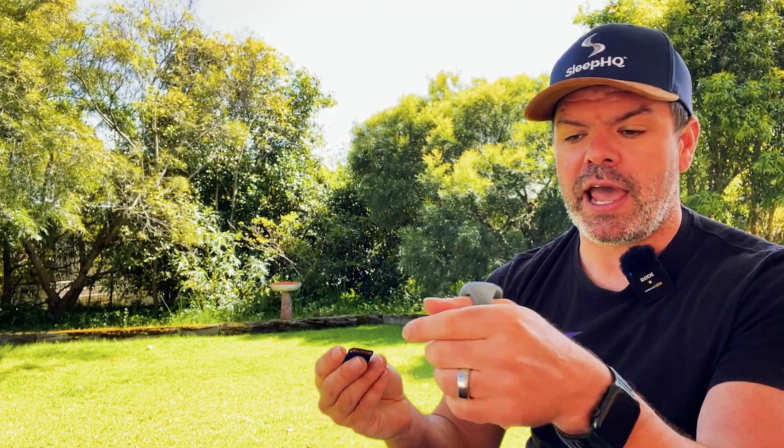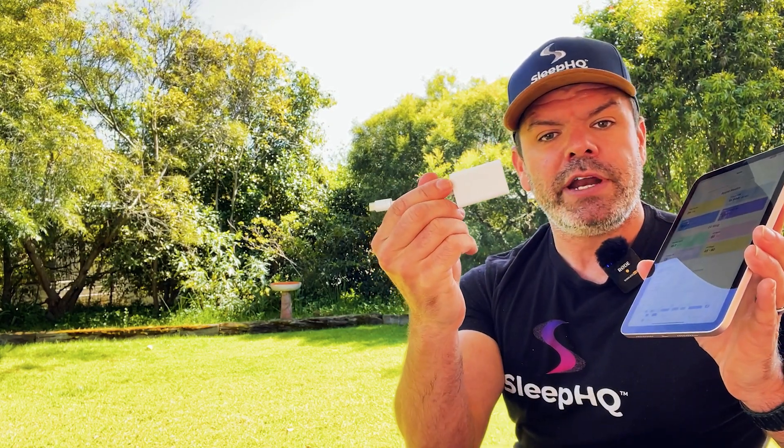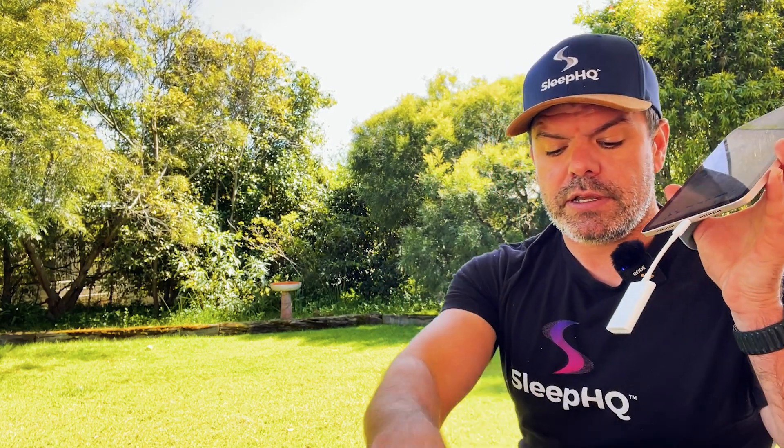The other option is you just take out the SD card from your device, open up sleephq.com, log into your account, and drag and drop the files from the SD card into SleepHQ to upload them. And finally — I think this is going to be a game changer — we're working on an On-the-Go card reader. You plug it into your device, put your SD card in, open up the app, and the files will transfer automatically. That's going to be super cool. I'm not sure if it'll be ready for version one, but it won't be long, that's for sure.